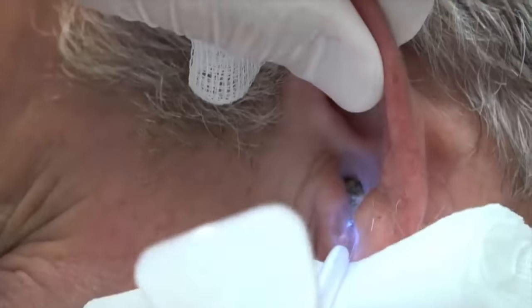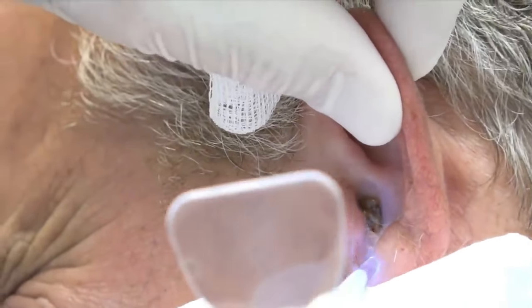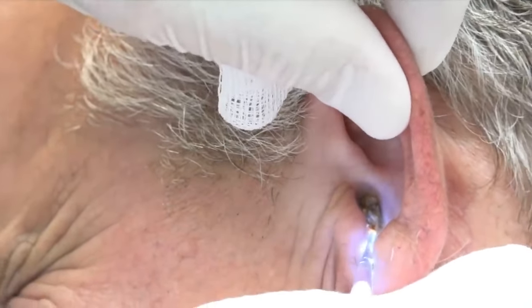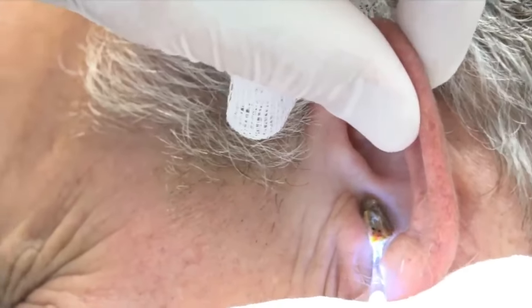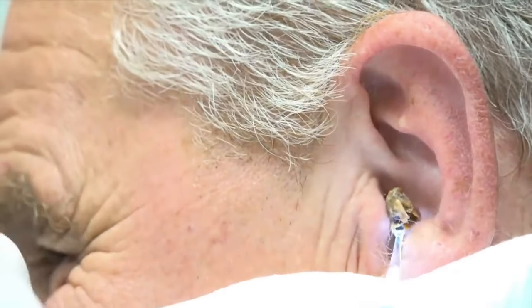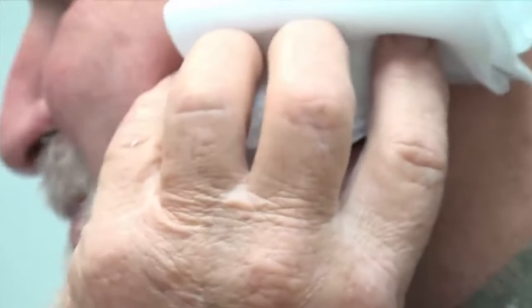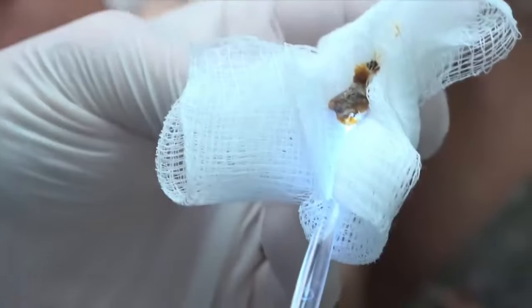And let's see that again in slow-mo. Here we go, speculum's in, lighted, something's coming out. What could it be? An enormous, monstrous collection of cerumen making its way now out of the ear canal for you to see. There. Hold on. You see that? Look at it. No, I can't see it. Hold on. Get up, up, up. There it goes. Yeah, there it is.